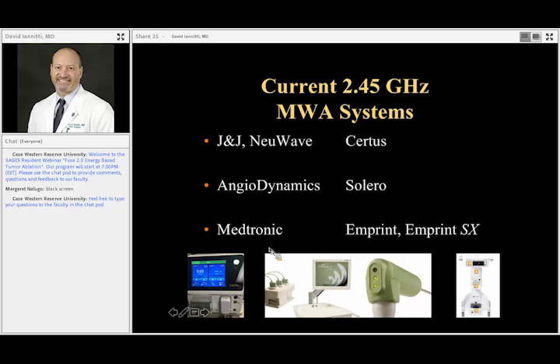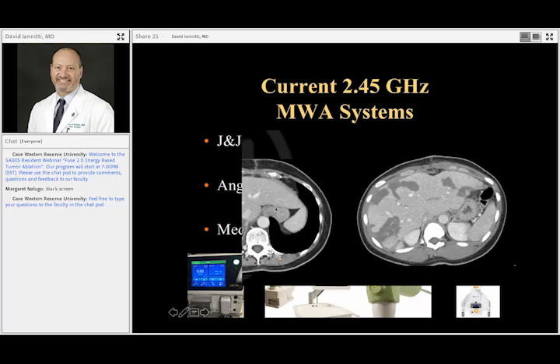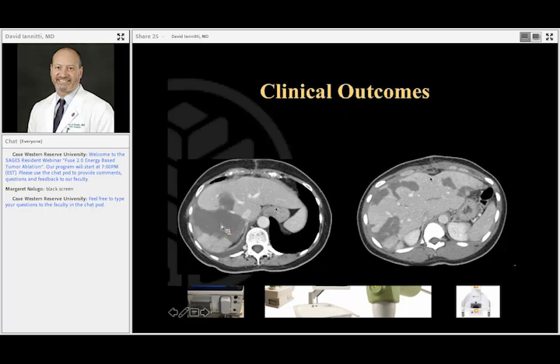Now, the nice thing about microwave is that we can do a lot more with microwave than we ever did with RF. We can do multiple ablations. I've ablated 50 lesions at once. And then some of the limitations: because you use conductive heating with RF, you always hear that you can't ablate anything greater than 3 centimeters. That's completely untrue with microwave.